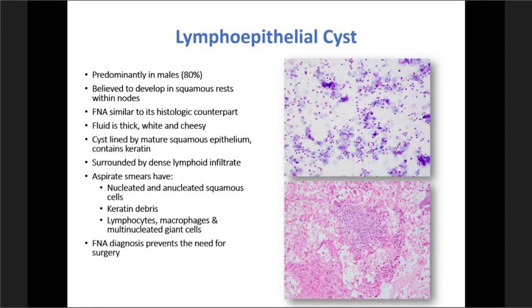Lymphoepithelial cyst, the name itself gives you an answer for anyone. I mean, this is basically a benign diagnosis, and that's why they want to really rule in or rule out cancer, and that's why these are aspirated.